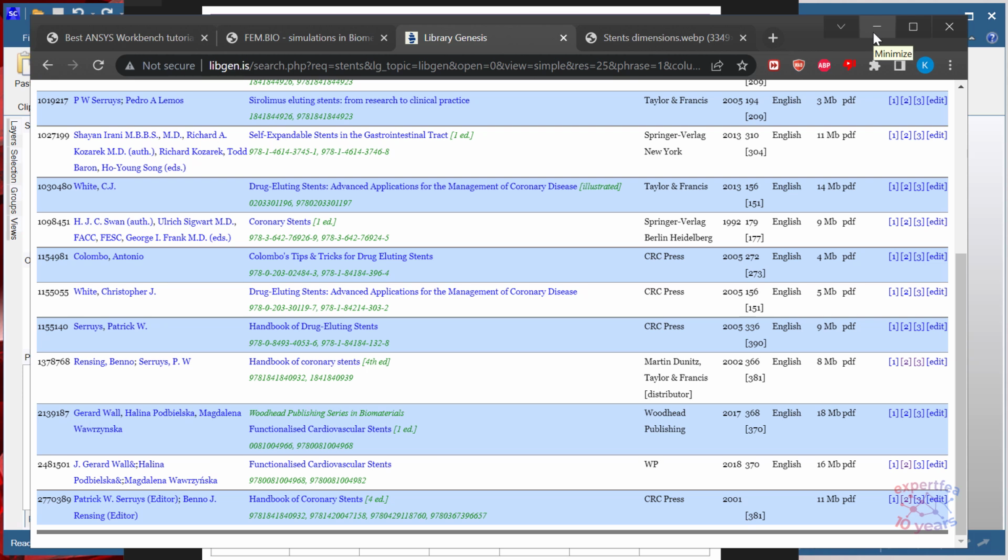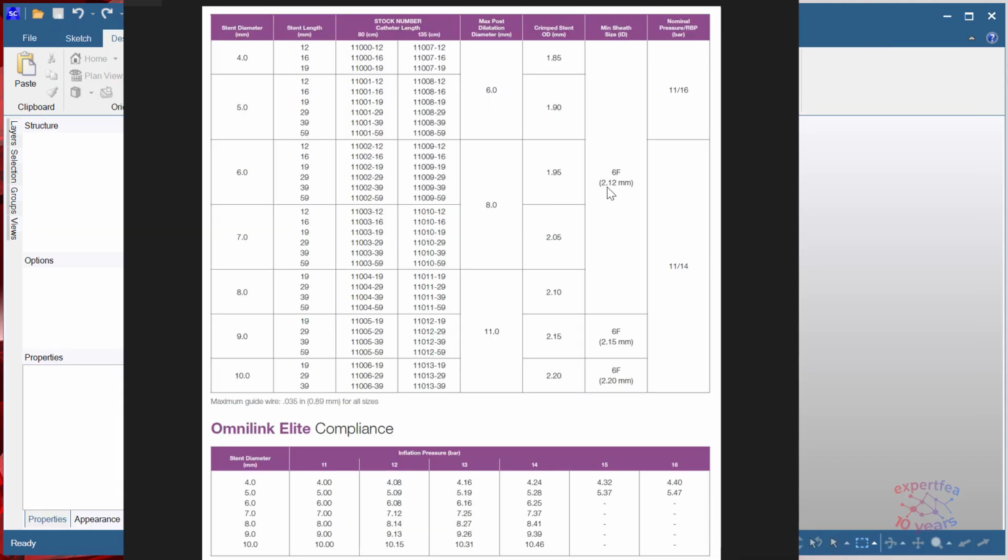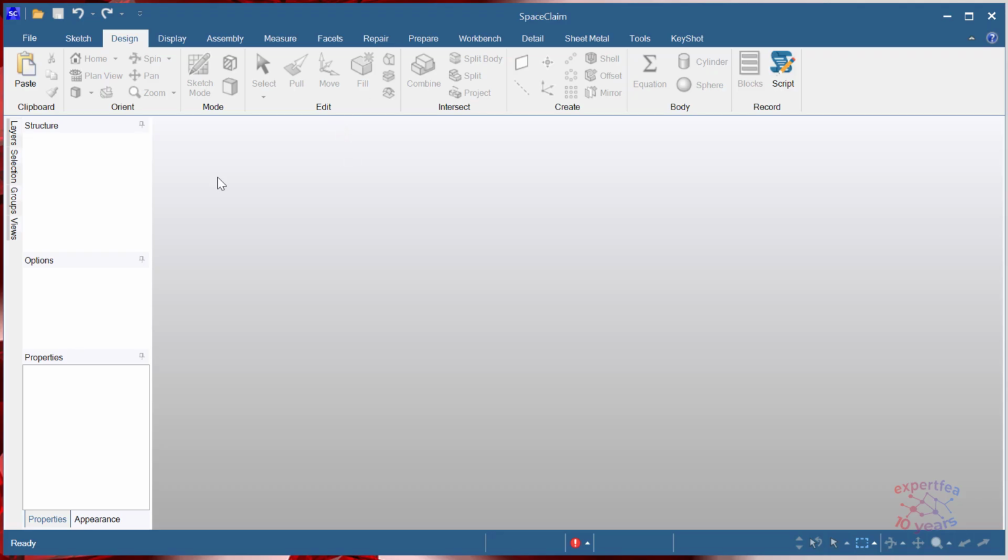So moving to today's case, I would like to model a simple stent with a diameter of around 5 mm, length maybe 16. In the end, the post dilatation should be around 6 mm, and the pressure that we use will be something between 11 and 16 bar. Divided by 10 will be around 1.1 or 1.6 megapascal. So let's move to the modeling side.